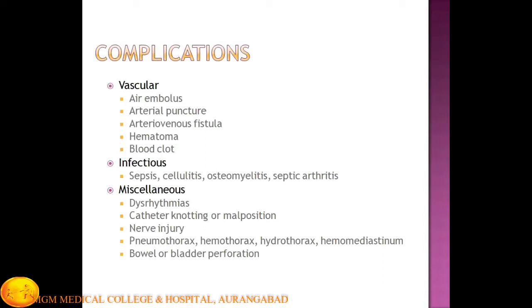You are trying to puncture the vein, but accidentally you can puncture the arteries surrounding the vein. So, arterial puncture. Because of the procedure, there can be formation of arteriovenous fistulas, hematoma, and blood clots. If you are not using proper sterility during the procedure, the patient can have an infection source. Your catheter can be a source of infection. The patient can land into bacteremia and septicemia.